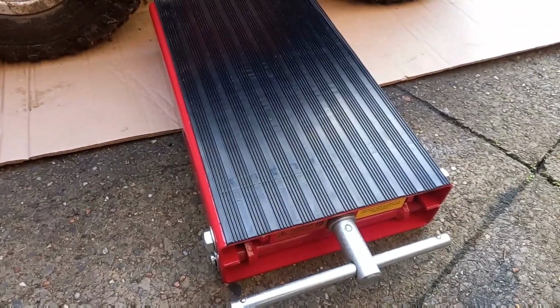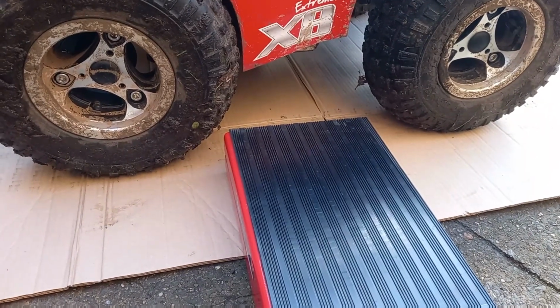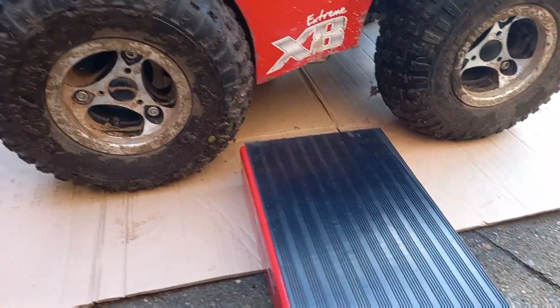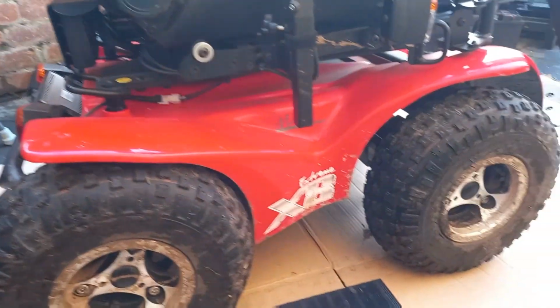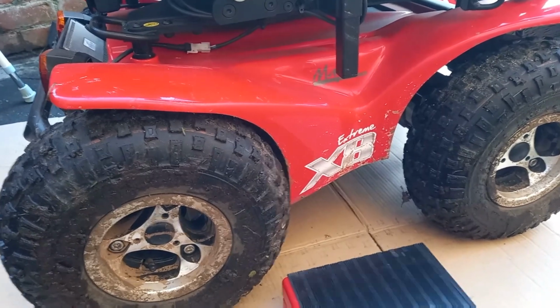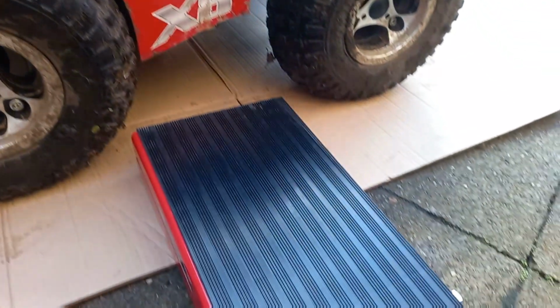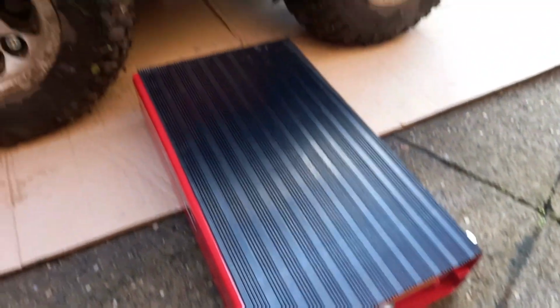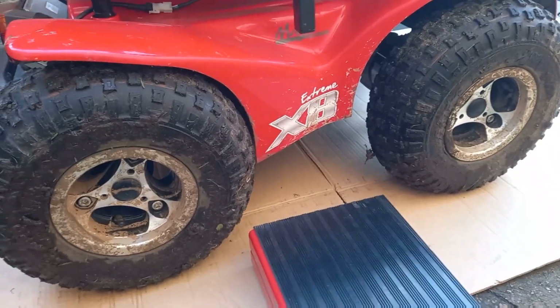We've got a lift, so that's going to go in so as we can jack it up, hopefully. We've not tried it yet, and he can sort of sit in his perching stool and try and undo all the fasteners and everything. Can't bend or kneel, you see. Because he can't kneel, he can't bend, he can't stand for long. Use my hands on the spanner. Yeah, he can use his hands on the spanners as long as there's not too much pressure involved, because then it mucks his shoulders up. So yeah, we'll check in later.